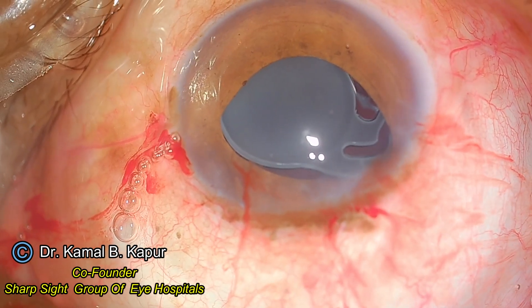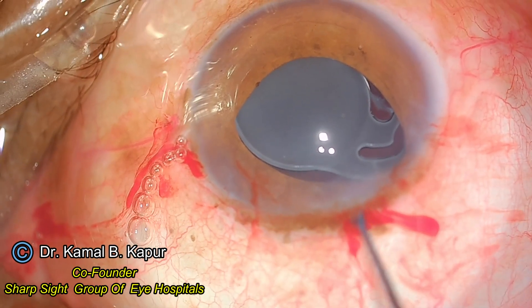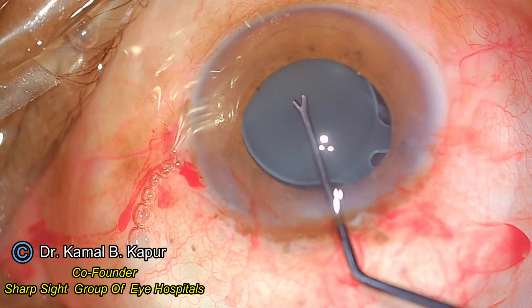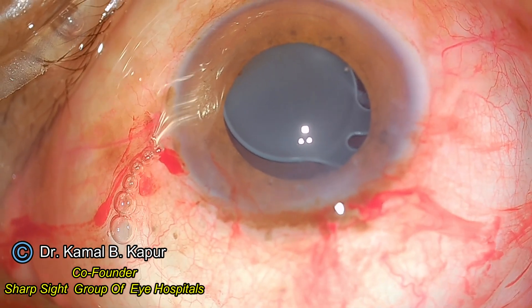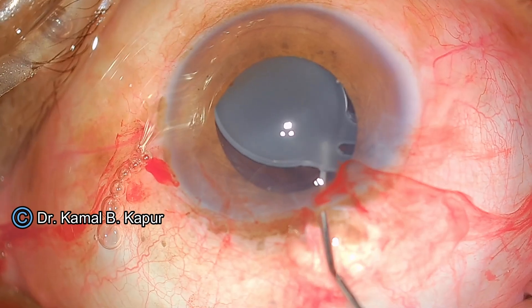I plan to cut the haptic away from the main optic of the lens — it is a 32-diopter IOL. I will again slightly try to rotate and see if I can push the IOL back in place so that it is aligned to my cutting axis. I push sodium hyaluronate viscoelastic behind the IOL.